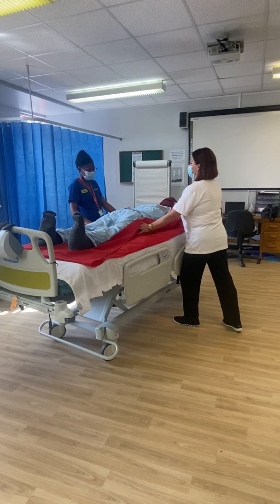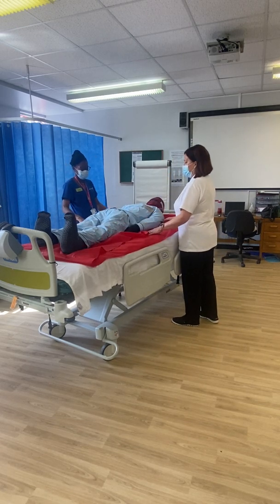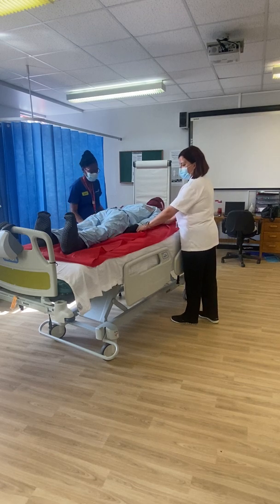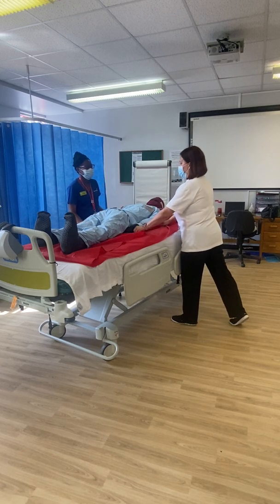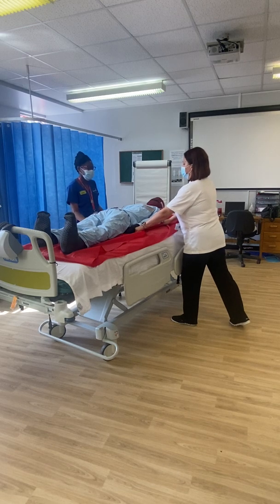Ready, steady, slide. We're then going to bring him back into the centre of the bed, and this time we swap our grip, so Priscilla is now going to be pushing and she's going to give the commands. Ready, steady.